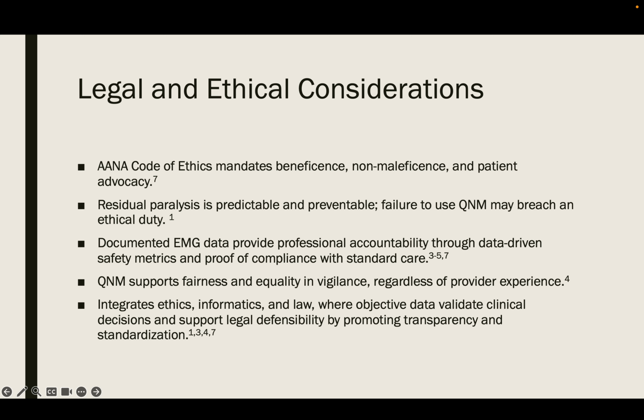Legally, EMG based monitoring provides objective timestamp documentation that verifies adherence to ASA standards of care and demonstrates due diligence in evidence-based practice. These quantitative neuromuscular monitoring devices also convert subjective assessment into data-driven safety metrics, enabling anesthesia providers to verify their performance against measurable standards of care. This transparency promotes ethical equity and patient rights, ensuring that every patient receives consistent, evidence-based care regardless of the provider's experience or setting.